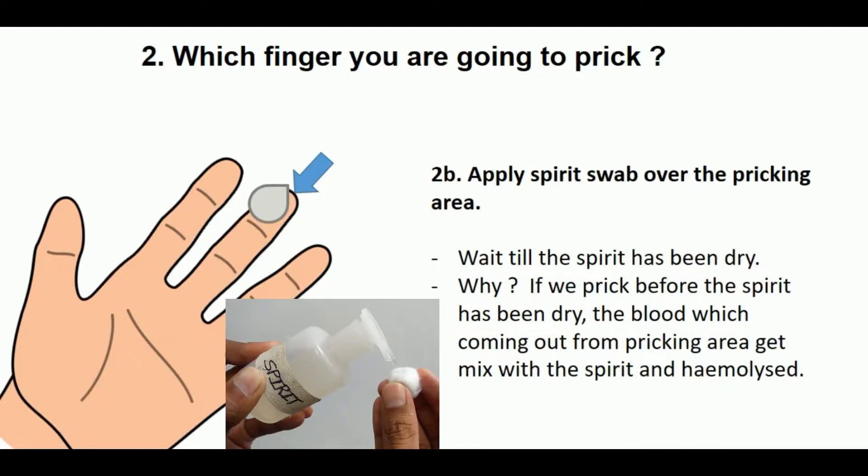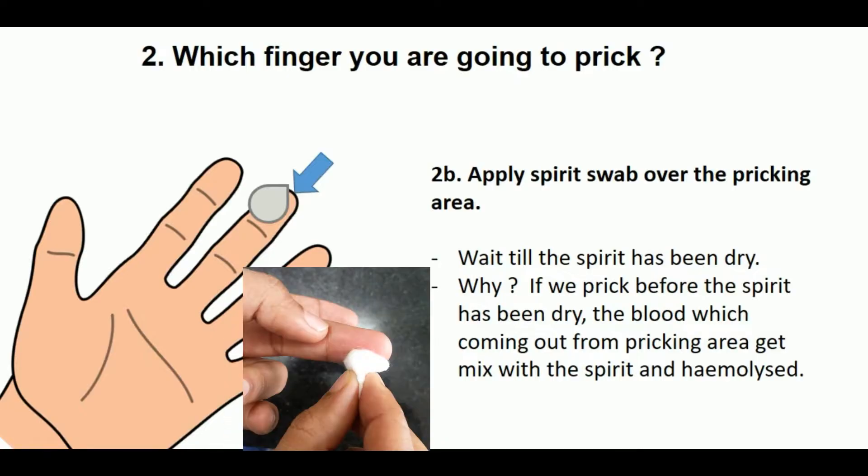Apply a spirit swab over the pricking area and wait until the spirit has dried. Why do we wait? If we prick before the spirit has dried, the blood coming out from the pricking area gets mixed with the spirit and becomes hemolyzed. So we need to wait until the spirit has dried.